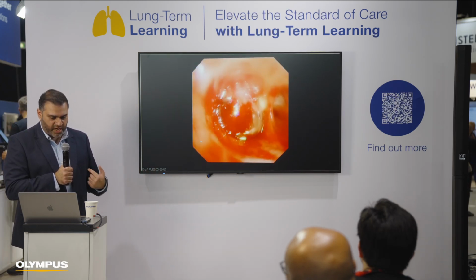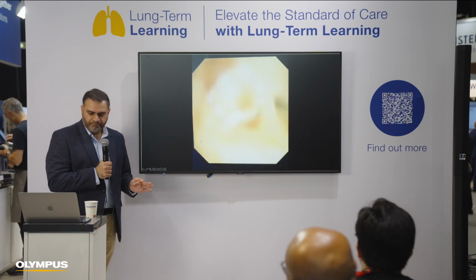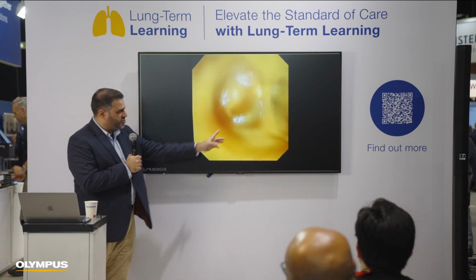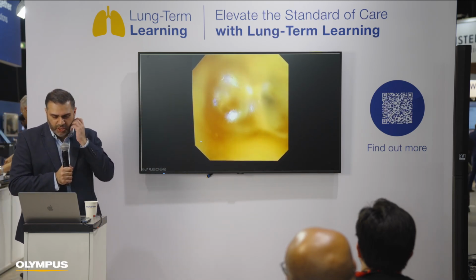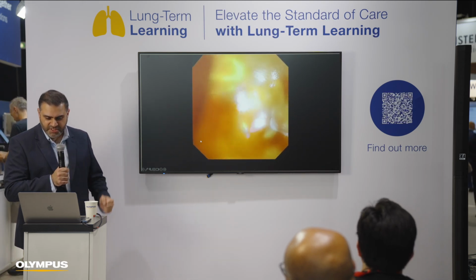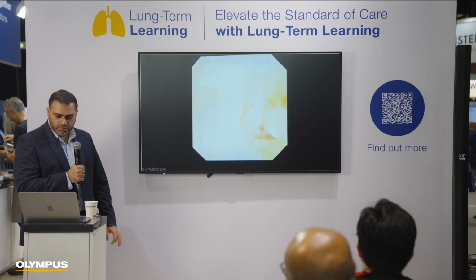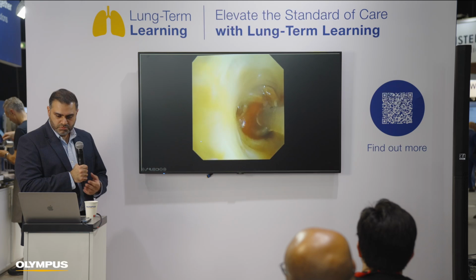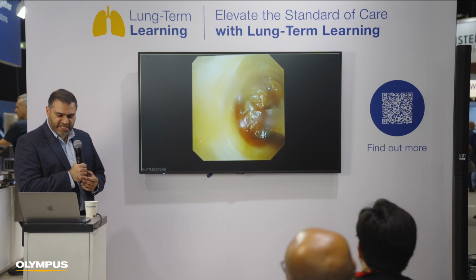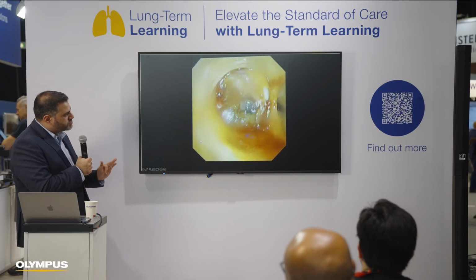But this is where the RDI for me really came into its own. So I switched to the RDI, and all of a sudden, actually, I can really, really focus on what's bleeding, just there. Blood pressure still raised, heart rate still a bit high. Mine's not the patient's. We put the electrocautery probe through the working channel. Deliver a little bit of thermal energy. Still feeling calm.